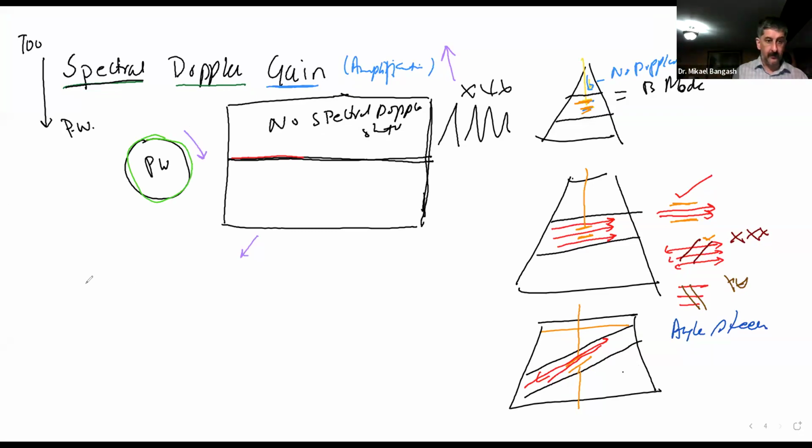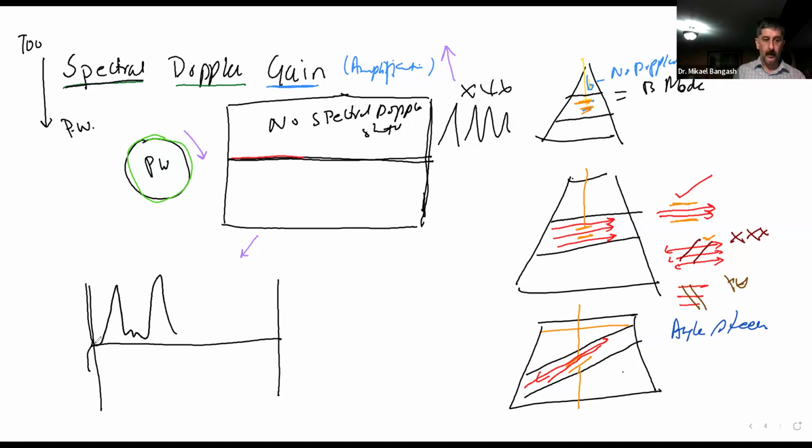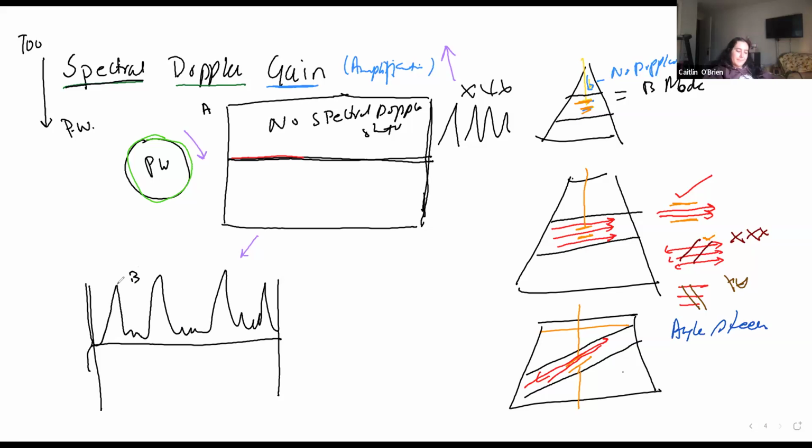That same spectral Doppler may now start giving us or displaying a graph. Did you guys get that? Yep. Okay.